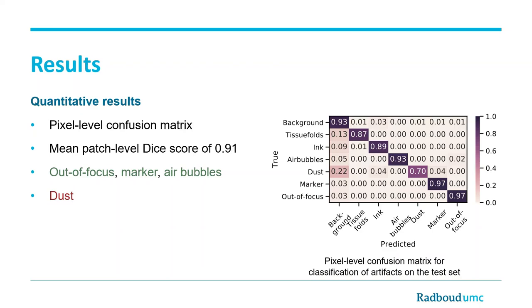To evaluate the performance of the artifact segmentation module, we computed the pixel-level classification matrix using the test set. Our method achieved an average patch-level Dice score of 0.91. For both pixel-level classification and patch-level evaluation, the performance on out-of-focus, marker, and air bubbles was the best.